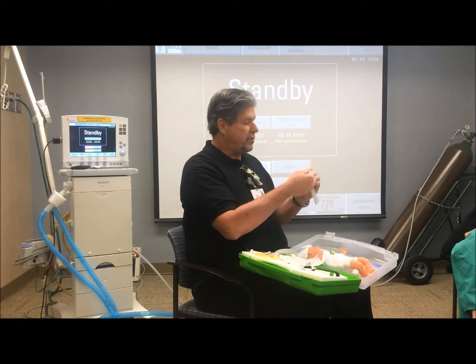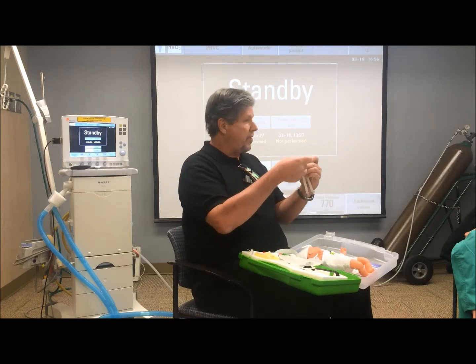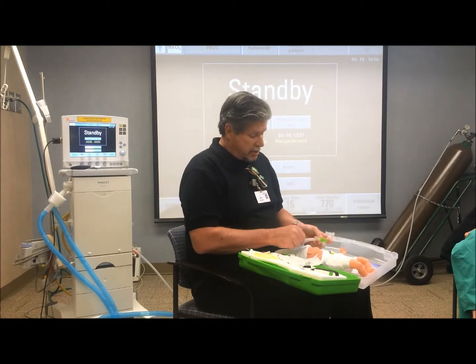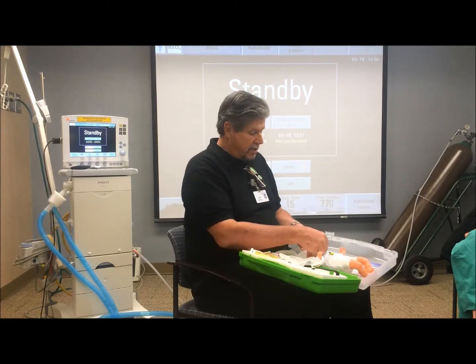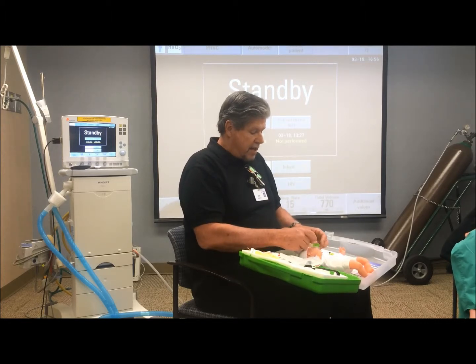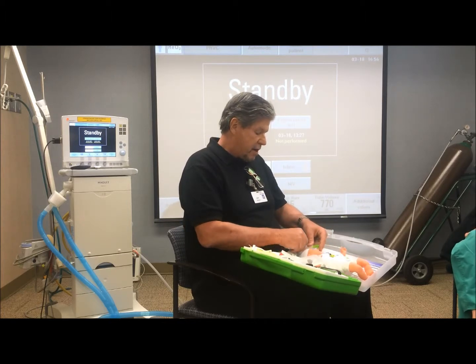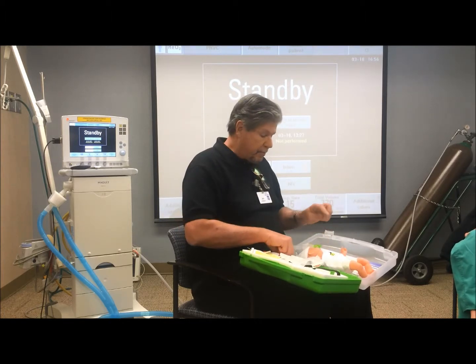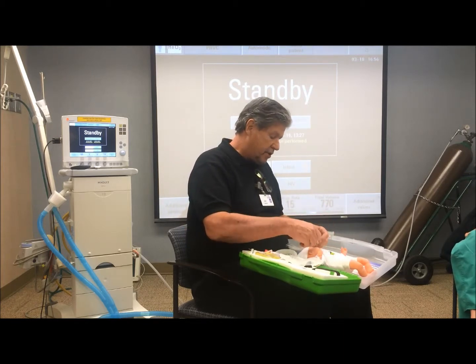So once you do, this has a little bit of movement to it, a little bit more than the other ones did. So you have a little bit more flexibility. So when you do that, then you get it in, you put it in the nares about halfway, and then you put that through this piece here. And then, but before you would do that, I would imagine that it would be easier to do this first.